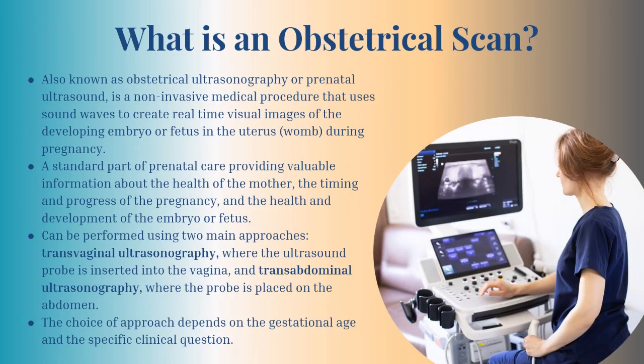What is an obstetrical scan? Also known as obstetrical ultrasonography or prenatal ultrasound, it's a non-invasive medical procedure that uses sound waves to create real-time visual images of the developing embryo or fetus in the uterus or womb during pregnancy. A standard part of prenatal care, it provides valuable information about the health of the mother, the timing and progress of the pregnancy, and the health and development of the embryo or fetus.